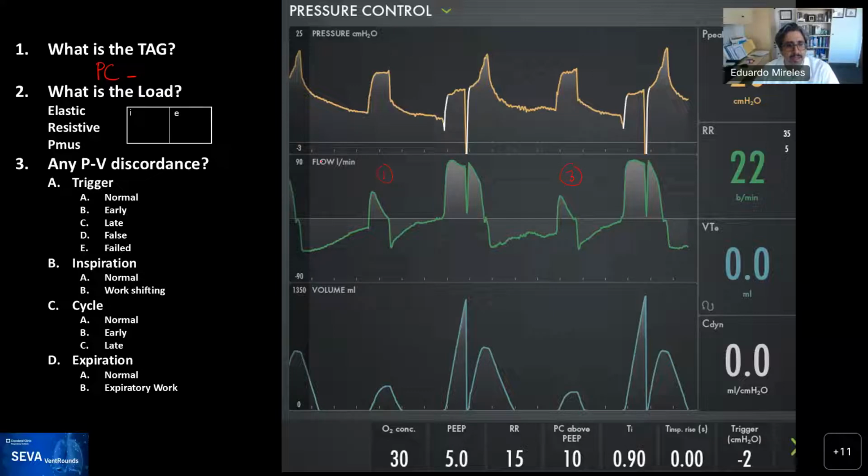So immediately you see here that when we see this breath in this ventilator in particular, will tell you if the machine is triggering or the patient is triggering. And they do that by changing the color on the waveform, on whatever value it's being used. So you can actually see here that the trigger is set to pressure down here. And the pressure actually changes color. It's white here. So over here, it's a passive breath, so it's triggered by the machine.